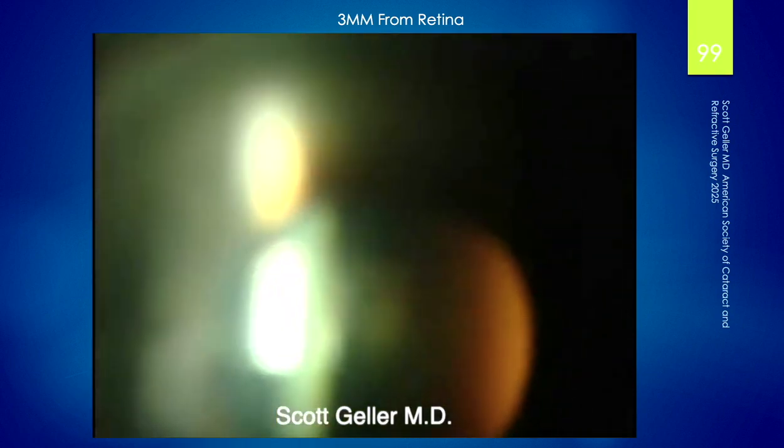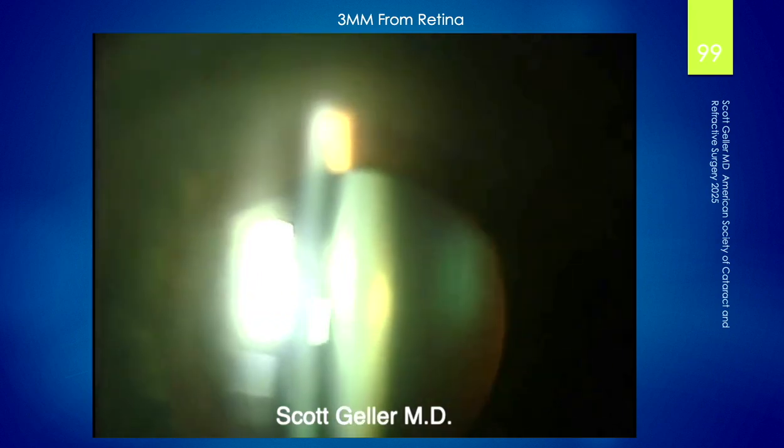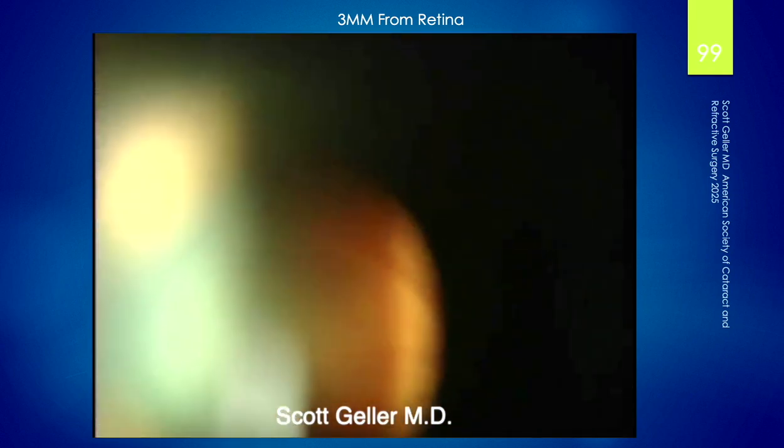Another case close to retina. How do you do it? Very carefully. Small pupil, phakic patient with a small posterior subcapsular cataract. Very close to retina. By the way, I always tell patients if they have a cataract in their eye, sometimes they're not diagnosed. When I say cataract, something like that, I tell them, you have a lens opacity, you should know that.